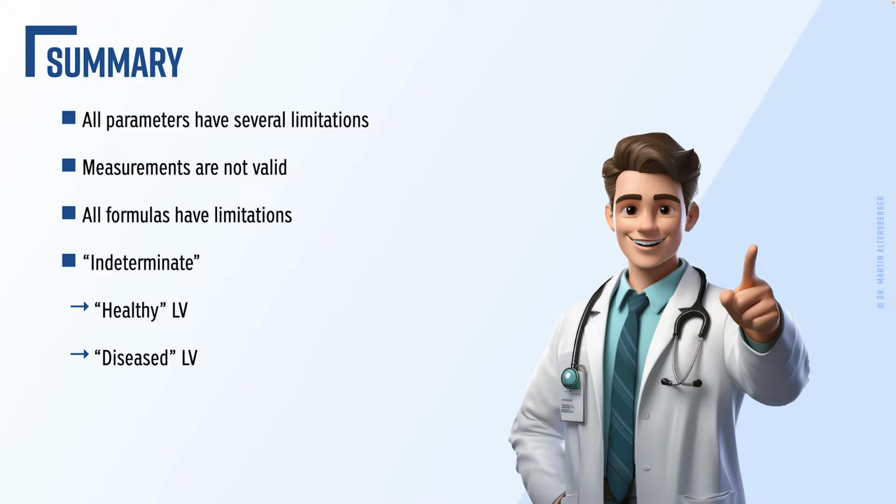In the last couple of videos, we talked already extensively about diastolic dysfunction, myocardial mechanics, individual measurements. And now it is time to continue talking about our guidelines, because not only is it important to know the measurements, but it's also important, and I was talking about it already quite extensively, to define whether there are normal or elevated filling pressures present. And in the guidelines, a very important topic to discuss is the situation of indeterminate filling pressures. So we have to differentiate: do we have a healthy left ventricle or a diseased left ventricle?